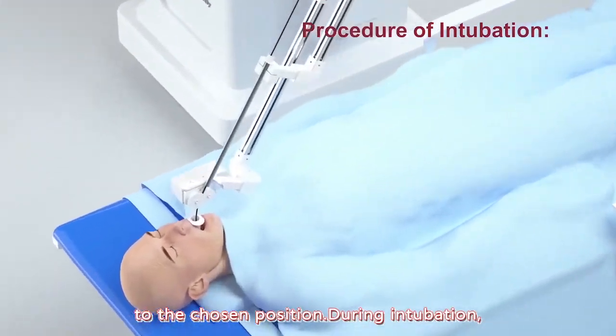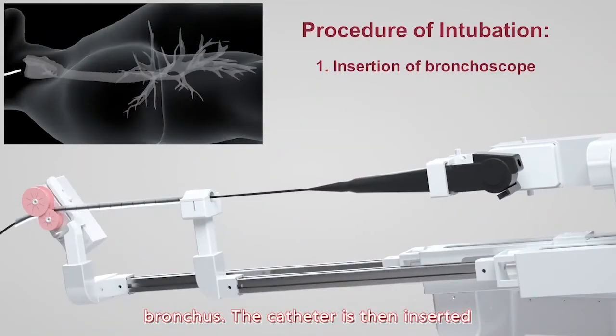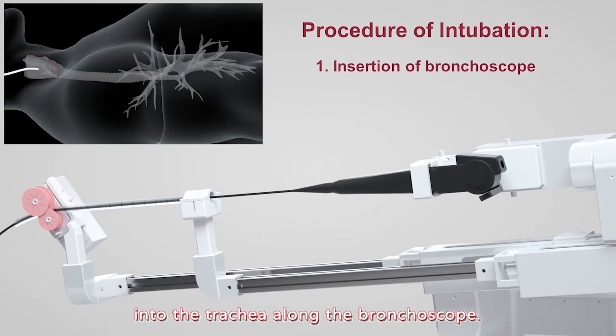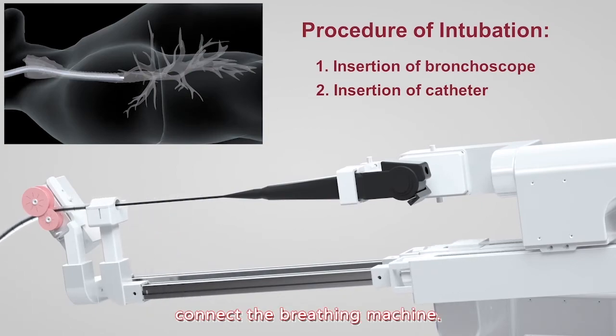During intubation, the bronchoscope is inserted to reach the main bronchus. The catheter is then inserted into the trachea along the bronchoscope. Finally, pull out the bronchoscope and connect the breathing machine.